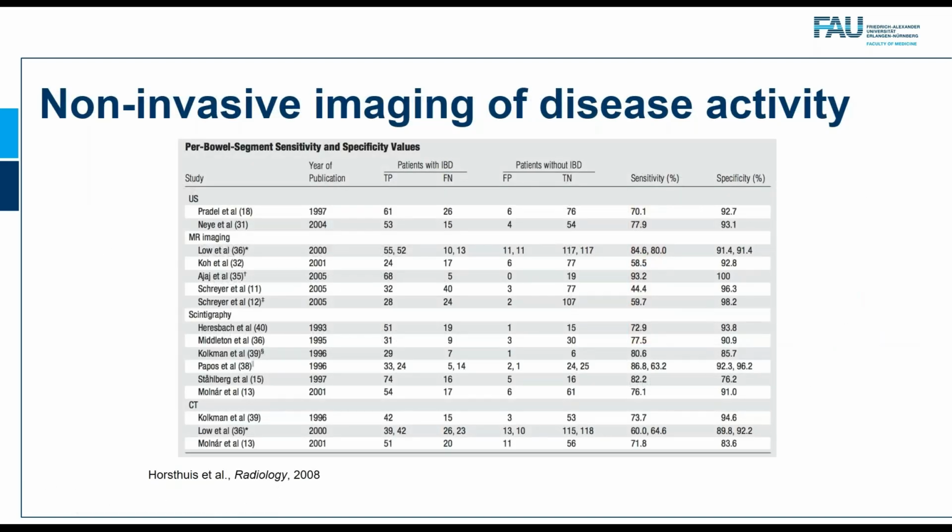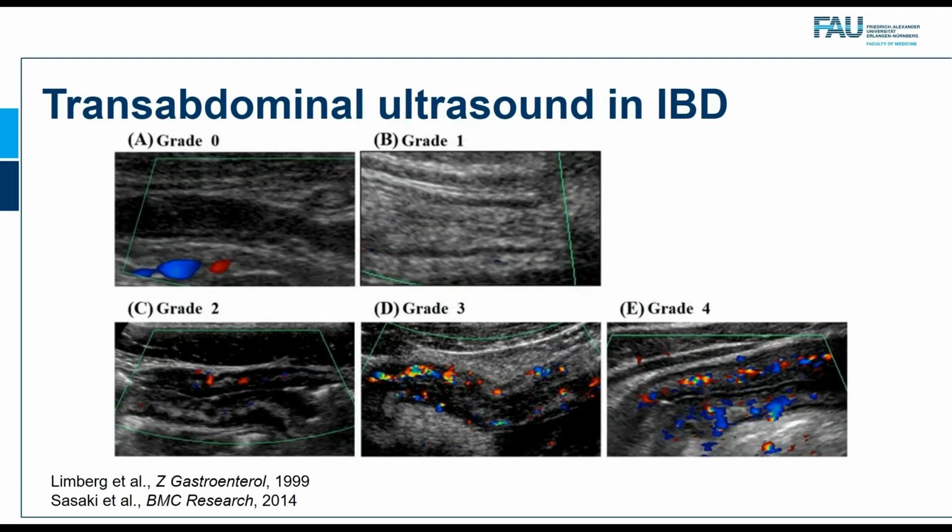One option here is non-invasive imaging techniques, for instance, ultrasound, MRI, scintigraphy, or computed tomography. Basically, all these techniques are comparable regarding sensitivity and specificity to evaluate disease activity in IBD. And as physicians in internal medicine, we are mostly interested in ultrasound because it's readily available in our wards and also in our outpatient clinic, and it can provide us very quick access to the required information.